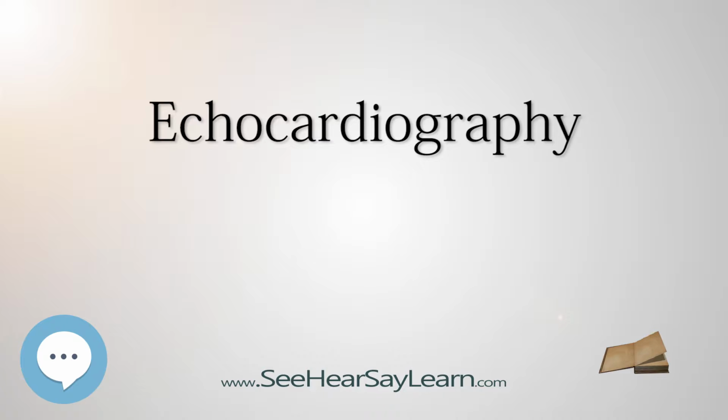In fact, Dr. Edler in 1953 produced the first echocardiographs using an industrial Firestone Sperry ultrasonic reflectoscope. In developing echocardiography, Edler worked with the physicist Carl Hellmuth Hertz, the son of the Nobel laureate Gustav Hertz and grandnephew of Heinrich Rudolf Hertz.